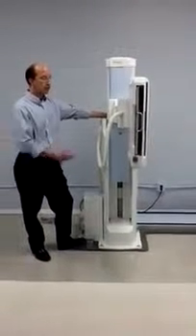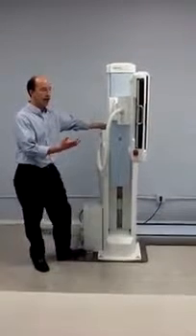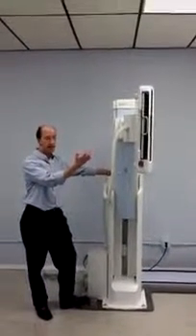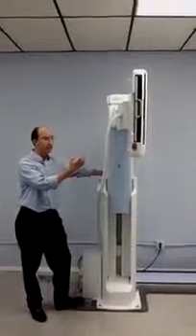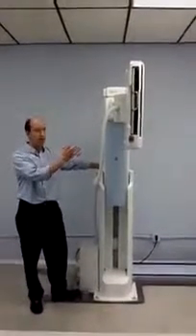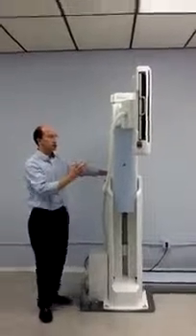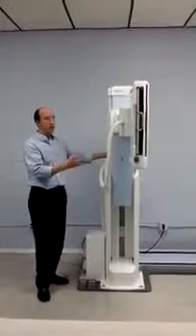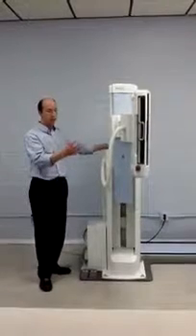As you can see here, we have the ability to raise the image receptor up to a very high height. This allows us to do chest imaging on even the tallest of patients. With button movement we can lower the image receptor.